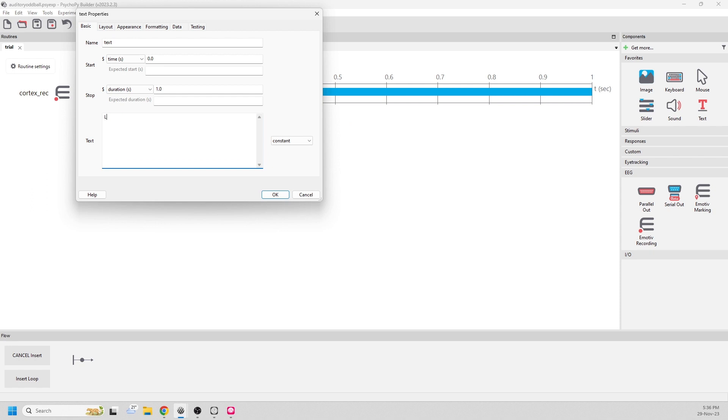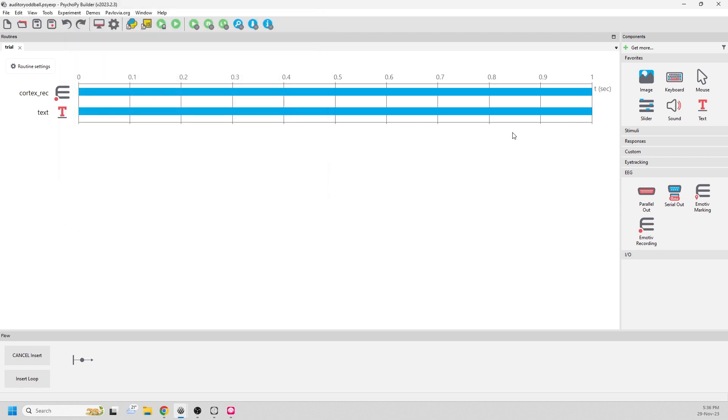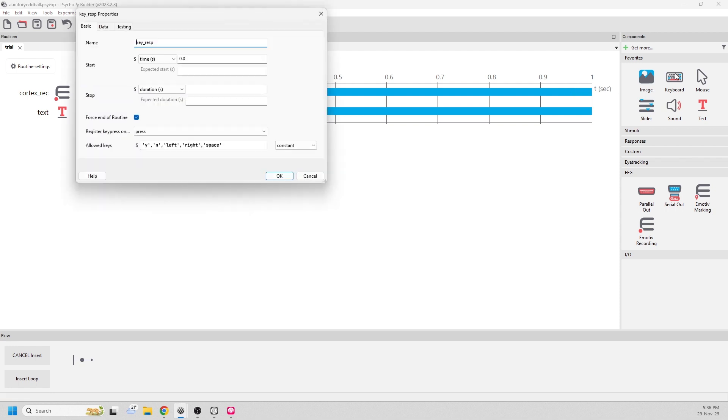We can say, listen to the tones and count the high tones. We'll add a keyboard routine so the participant can progress to the next stage.